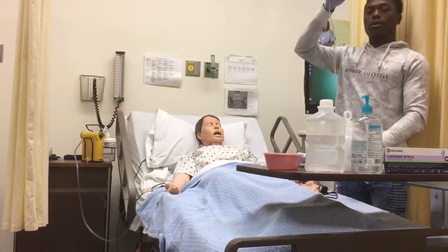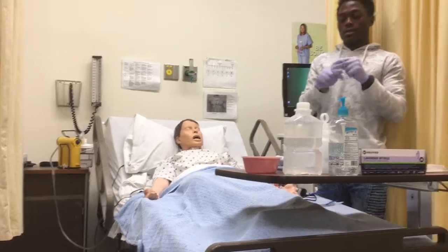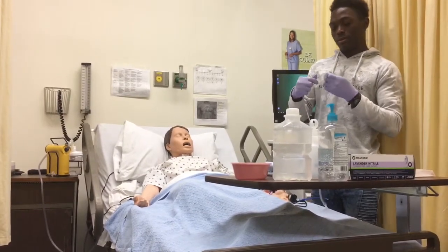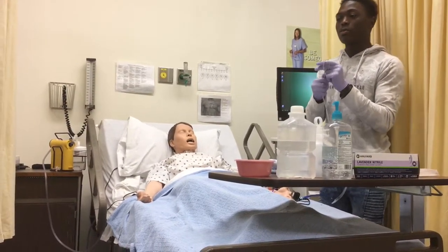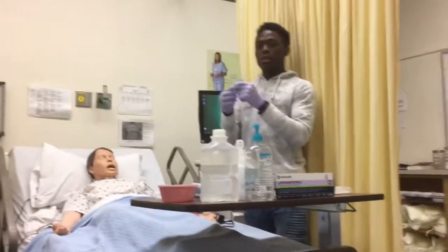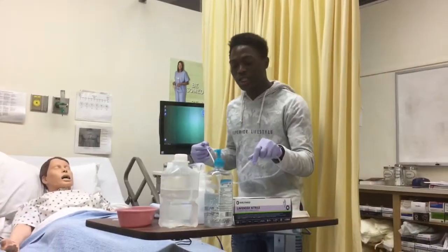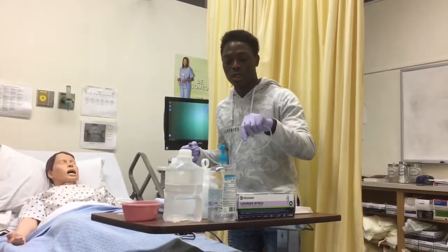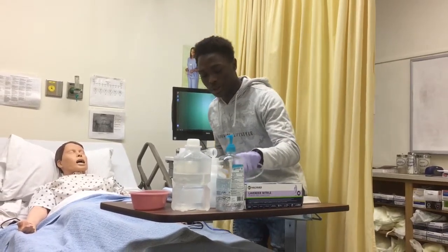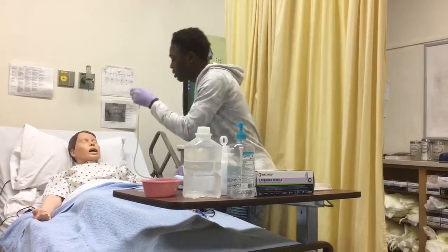And I am going to wrap this tube around my fingers to soften it a little bit, and it helps the tube enter the patient's nare more easily. So you're going to dip your tube into the water soluble lubricant, 3 to 4 inches. Okay, that's going to help provide facilitation.